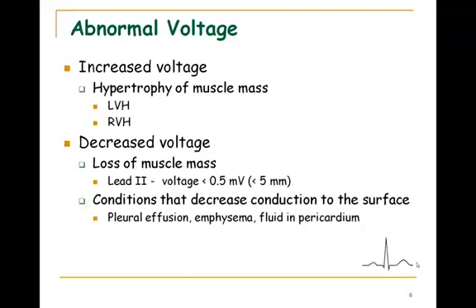Einthoven's law says, he happened to notice this, that the sum of the voltage of leads 1 and 3 always equaled 2. So that's something I just wanted to tell you. If you look at 1 and 3, adding them together is always going to equal 2. So that's a good rule of thumb to remember.